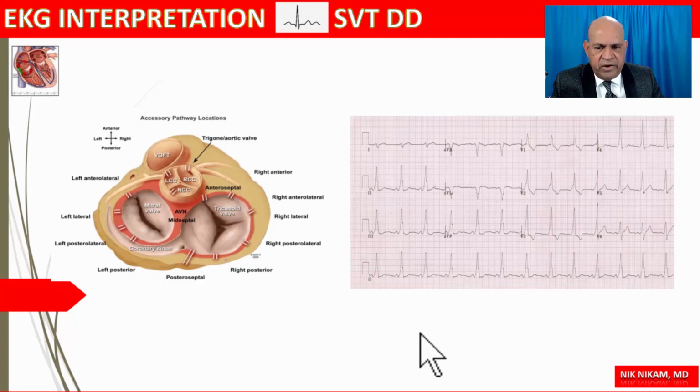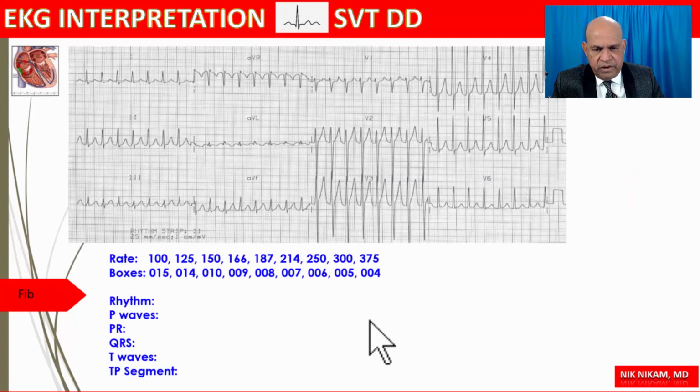When patients develop tachycardia, we're going to see positive deflections in the anterolateral leads. Next, and here's a similar tachycardia with a rate of approximately 170 beats per minute. And as we can see, the RR intervals are slightly variable. We have a narrow QRS tachycardia. If we see any delta waves like here, then we may be dealing with a supraventricular tachycardia in a patient with WPW or Wolff-Parkinson-White syndrome.